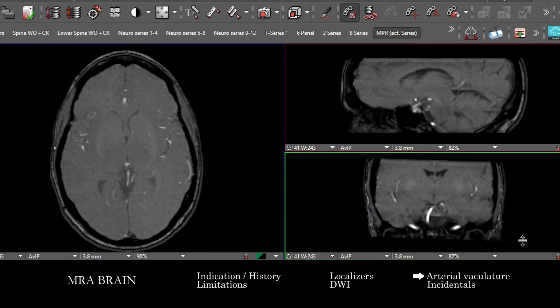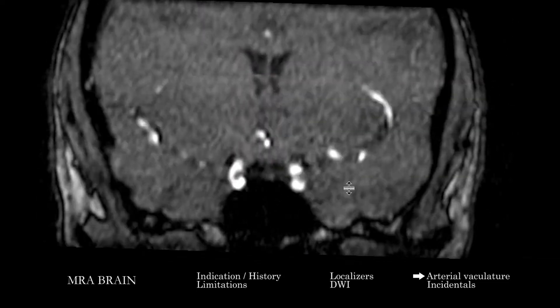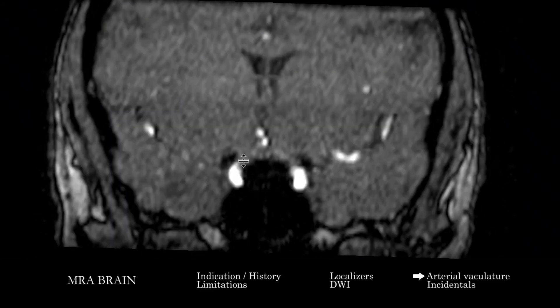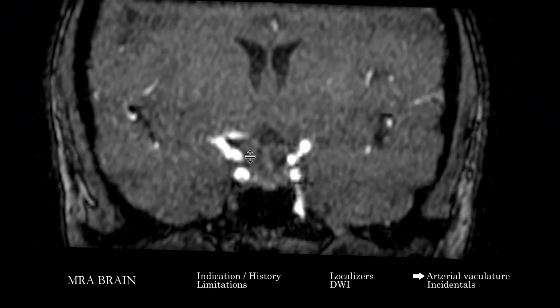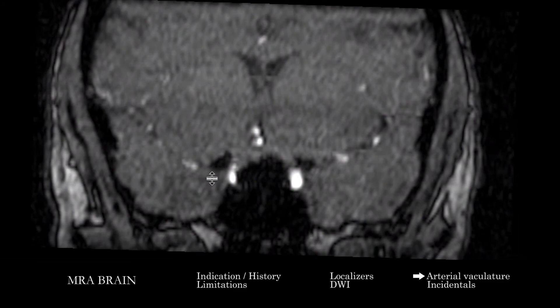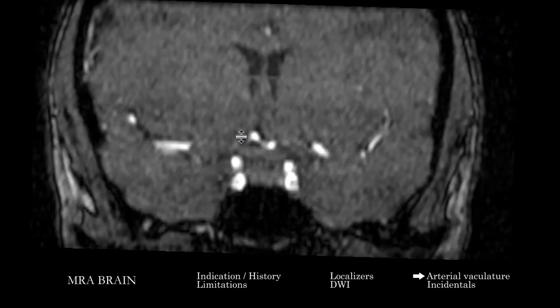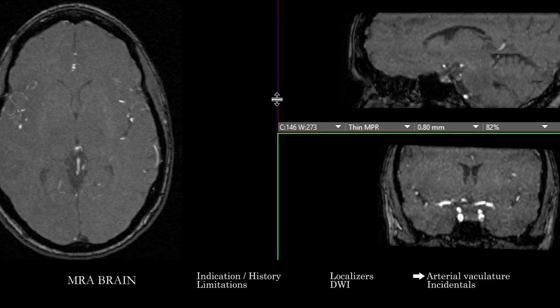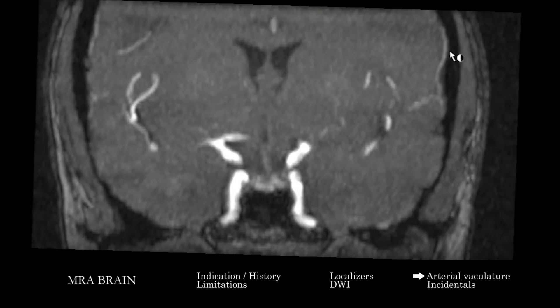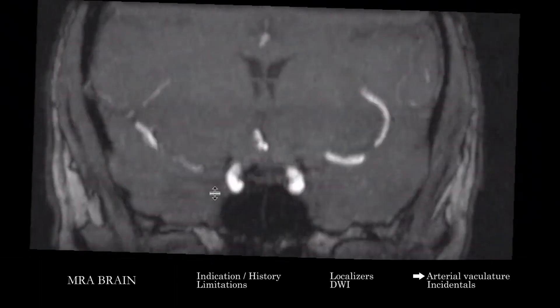Axials and coronals are a nice combination for the anterior circulation. I'm particularly careful to look at the carotid siphon area — the ICA cavernous segment and up into the bifurcation communicating area — on at least two projections, because subtle abnormalities here are easy to miss. Aneurysms at the carotid terminus can be difficult to see on just the axial, so I make sure to correlate. I'll then do both sides for the anterior circulation.